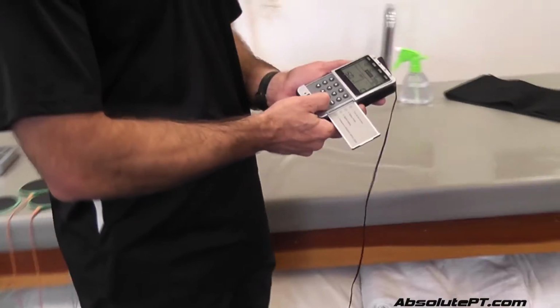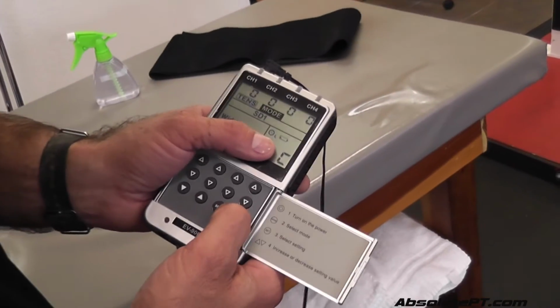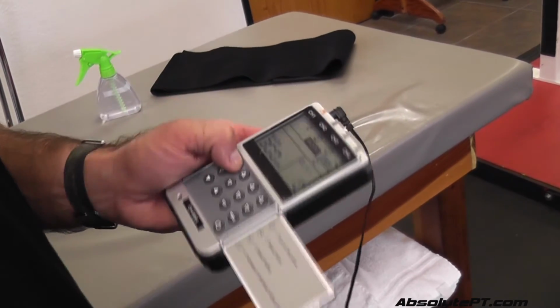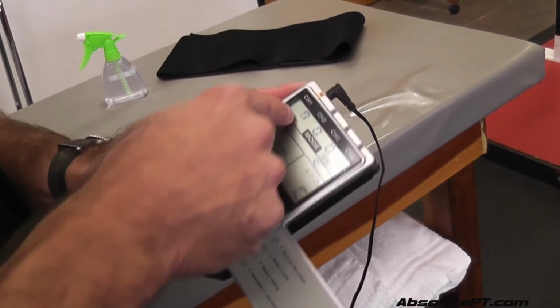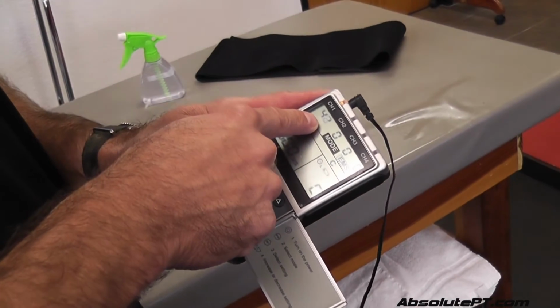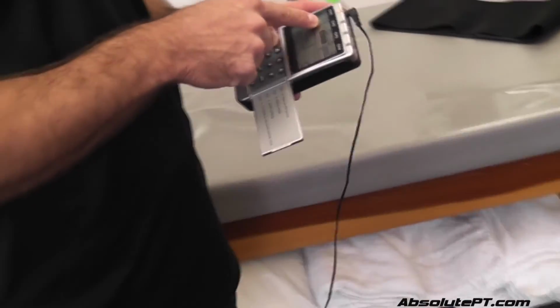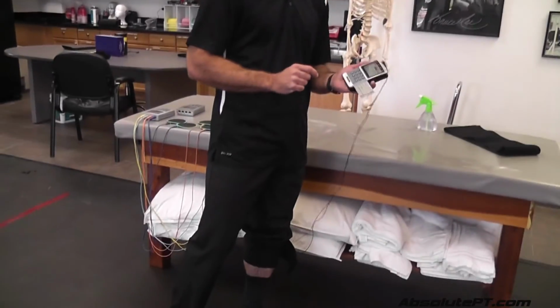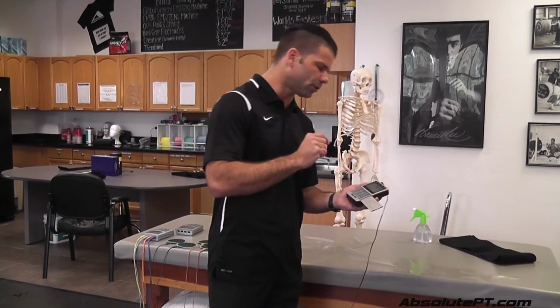And so I press my power button now. I go mode, okay, to where that says C, so I have a continuous contraction. And now that I'm there, I take the channel I'm working on, channel 1, and I just start upping my milliamps to as much as I can take. And I'm feeling it pretty strong right now. Okay, hella strong. Not Globus strong, but it's pretty darn strong.